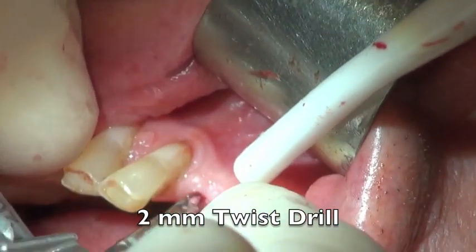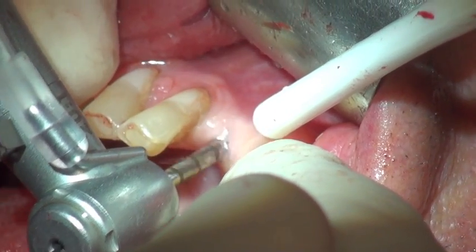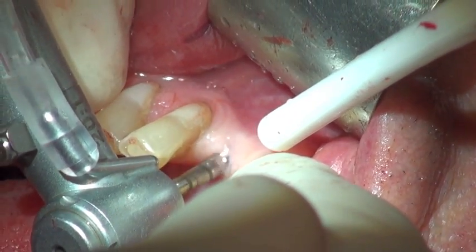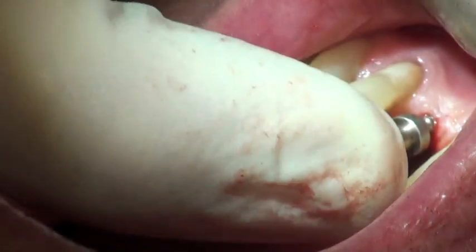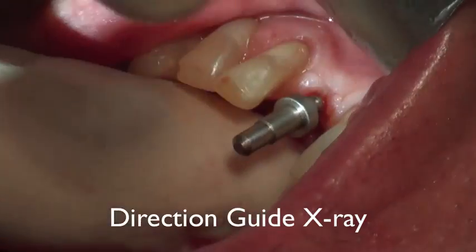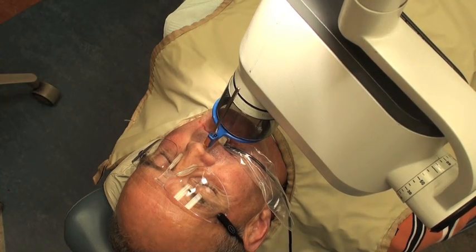Next we follow that with a 2mm twist drill which follows the position of the precision drill. This keeps us on target because it's all about angulation when placing these lower anterior implants. We place a direction guide so we can take an x-ray and check that we're on target before we go to full length.